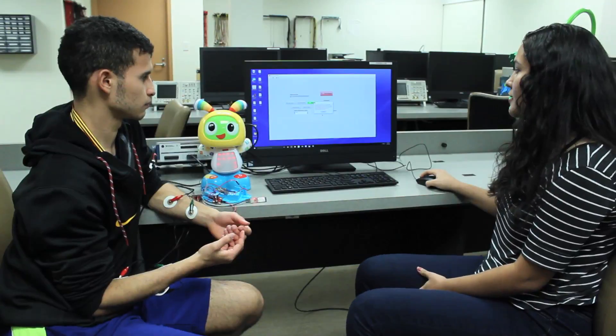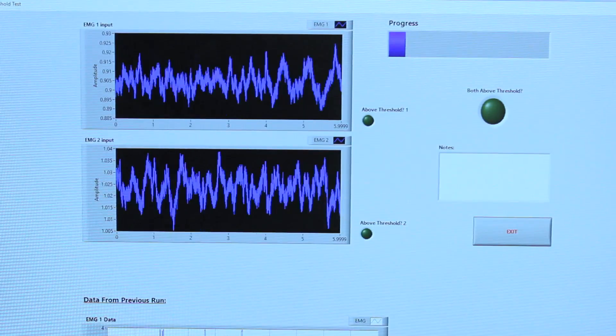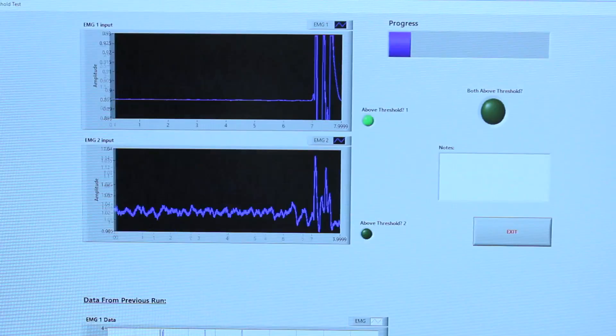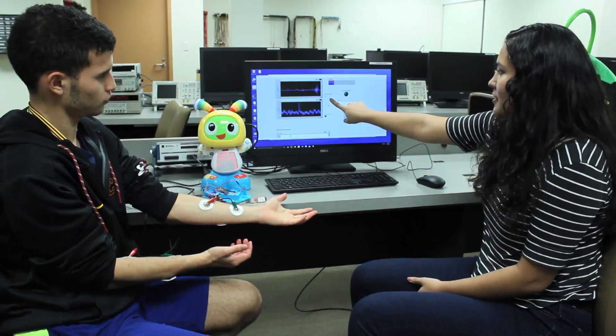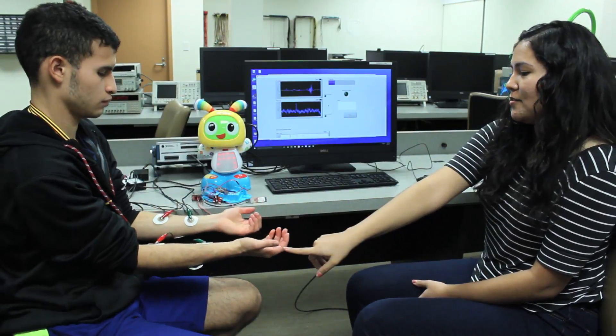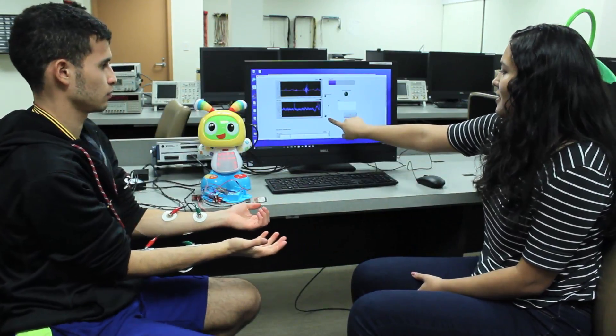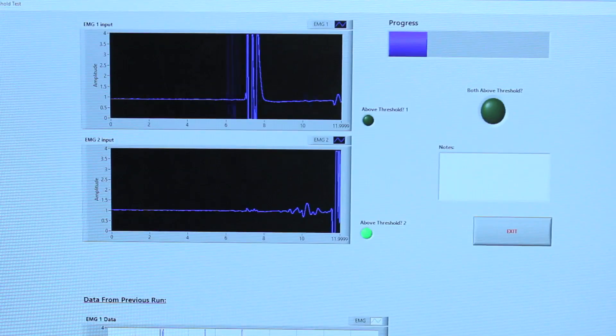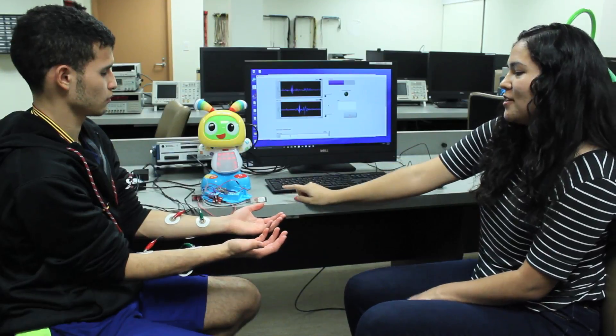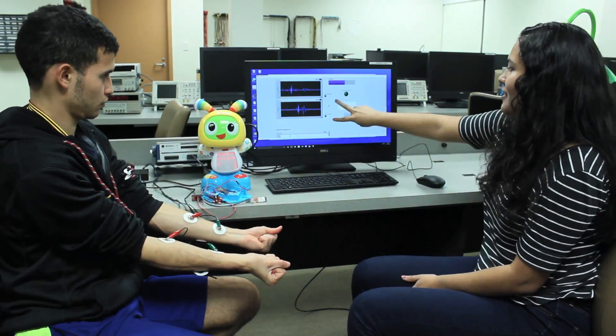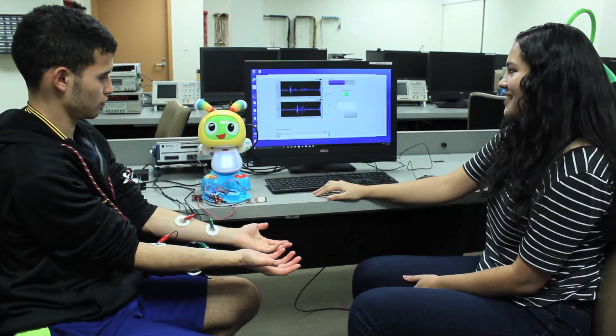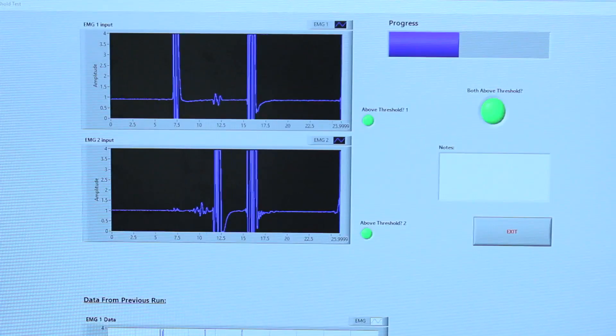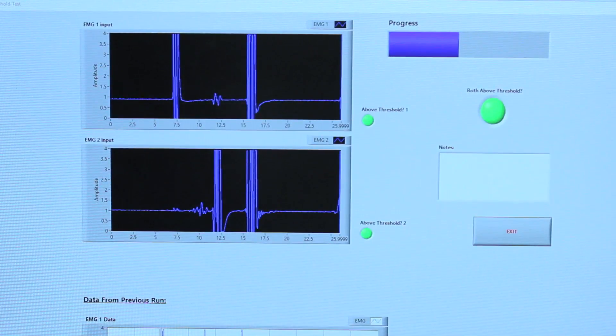Then you can begin your session. Now the session is running. If Oscar clenches the tibialis anterior, it's going to turn on this green light. If he clenches the quadriceps, it's going to turn on this one down here. If he clenches both, this is what's going to activate the toy.